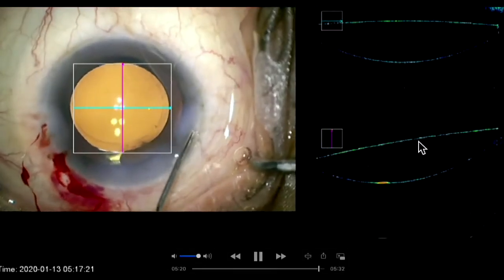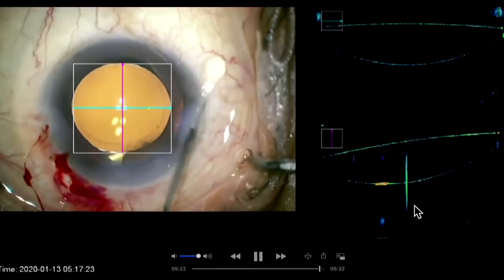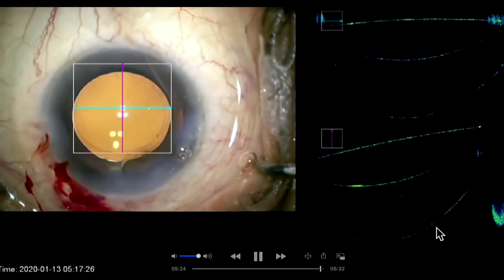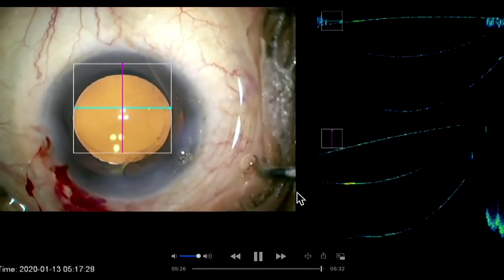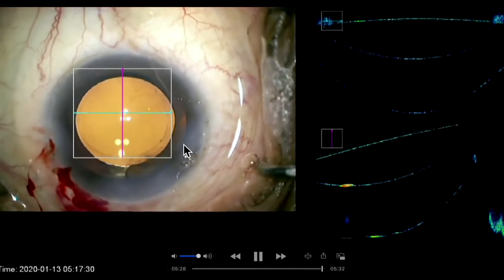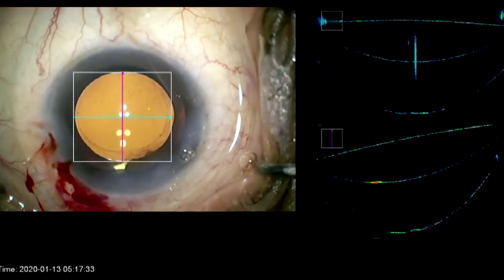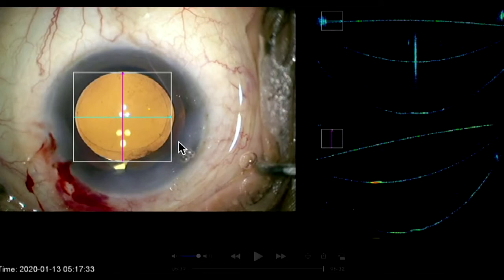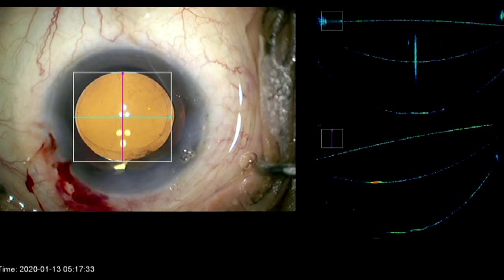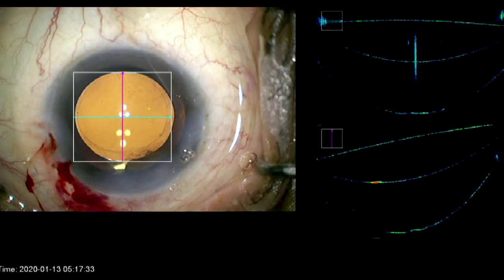You can see the lens is stable despite increasing posterior pressure. The wound is hydrated by performing wound hydration to make it thicker and seal it. This is the end of surgery. You can see the lens is nicely placed, it does not move with pressurization — meaning the lens is well placed in the bag. This is how a normal surgery would go comfortably with a routine cataract like this.